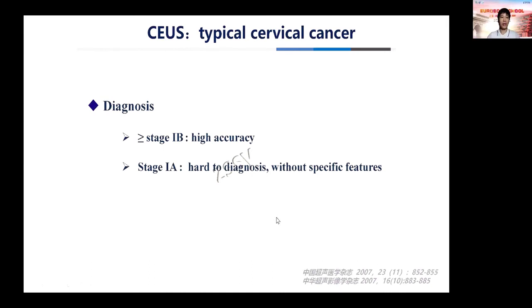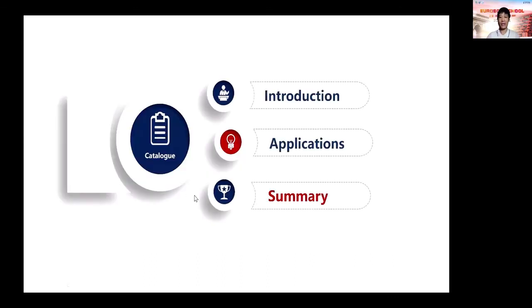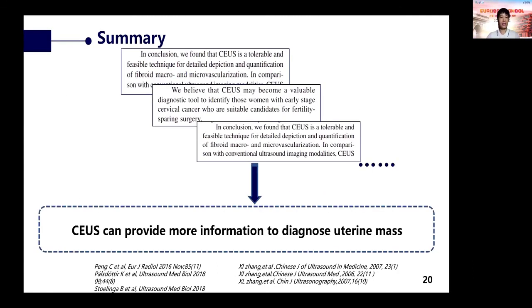However, the published study suggested that CEUS can help to find out the lesion larger than 1B, but show no benefit in diagnosis of stage 1A. Then the summary.